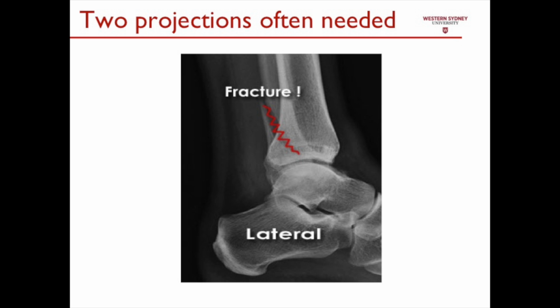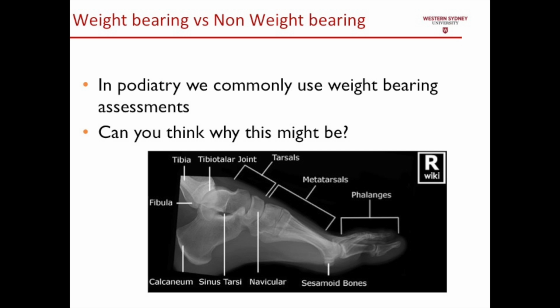In terms of body positioning, in podiatry we will often want perhaps a comparison between a weight-bearing and a non-weight-bearing view. In terms of this image, you can see that we have quite clearly a non-weight-bearing view. We can see this because we can see the plantar surfaces of the soft tissues appear curved, suggesting that they are not taking weight on a weight-bearing surface, and we can get an appreciation of this in terms of the architecture of the medial longitudinal arch.